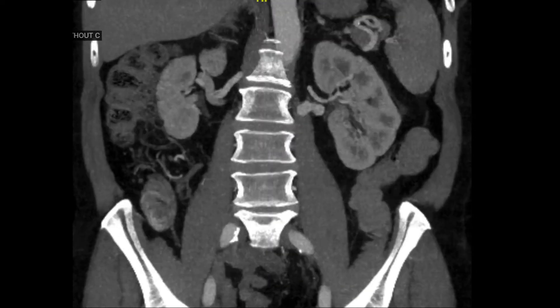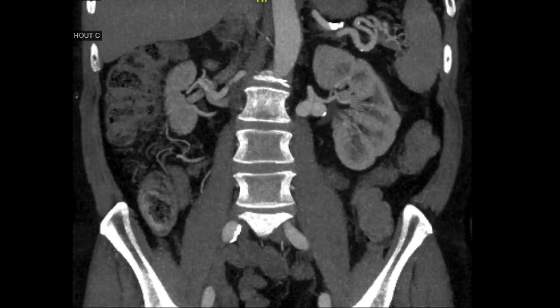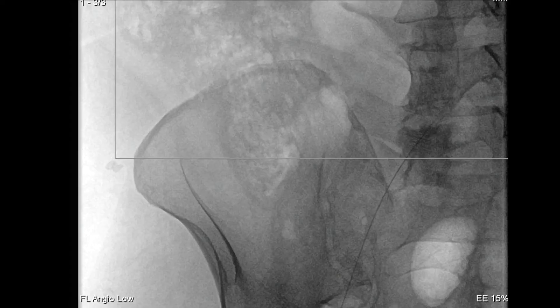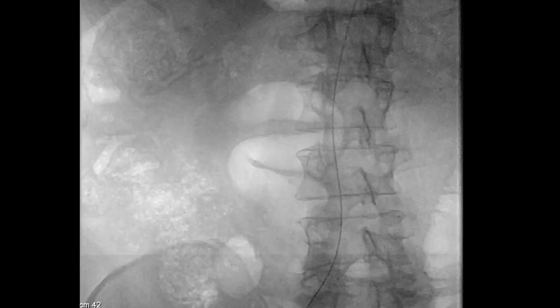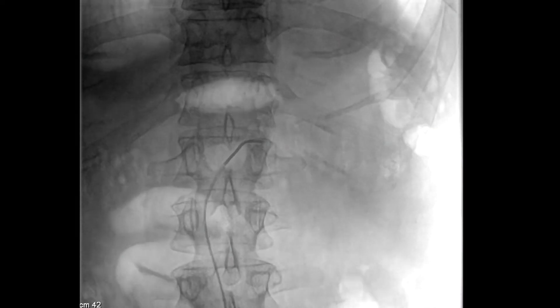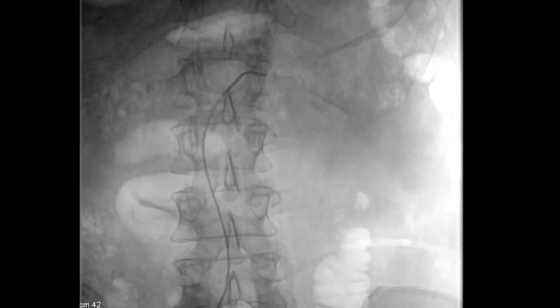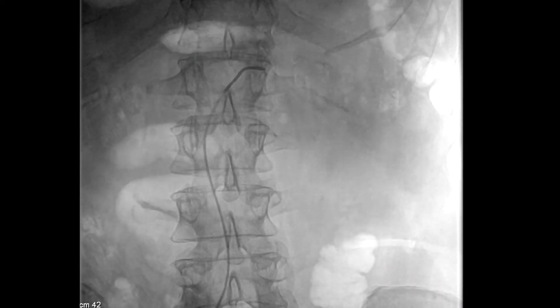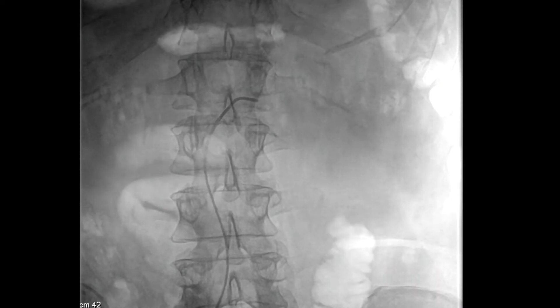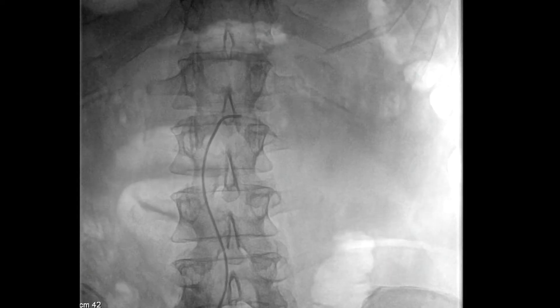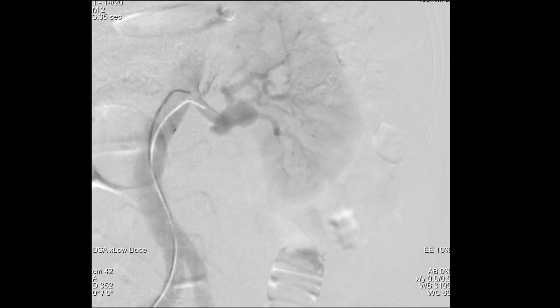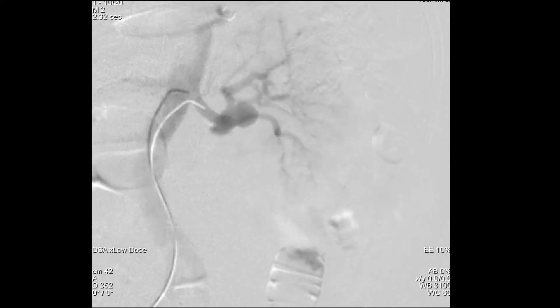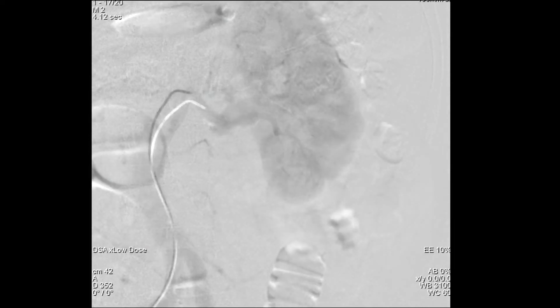We decided to repair this aneurysm endovascularly under ultrasound guidance. The right common femoral artery was accessed with a mini-stick needle, followed by the wire and introduction of a C2 catheter. This was followed by cannulation of the renal artery and performing a renal artery angiogram.